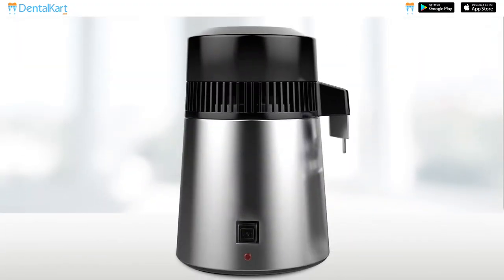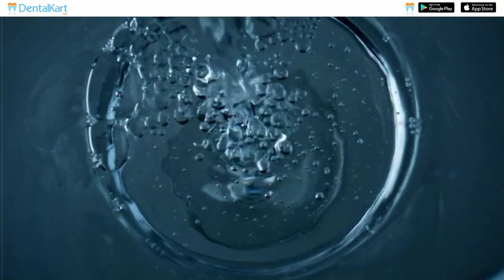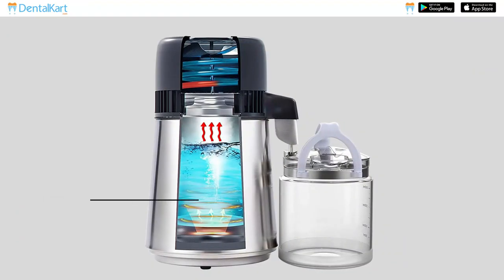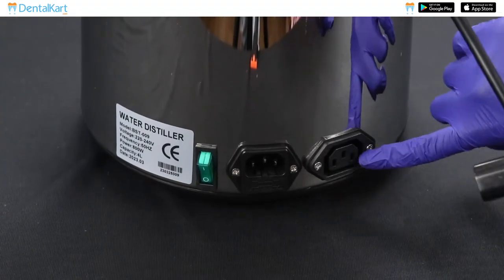Walden Water Distiller has a stainless steel body that is durable and compact. It produces water in the safest and cleanest condition through the process of boiling, steaming and condensation. It is easy to install, operate and maintain.